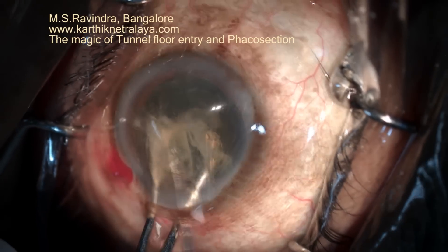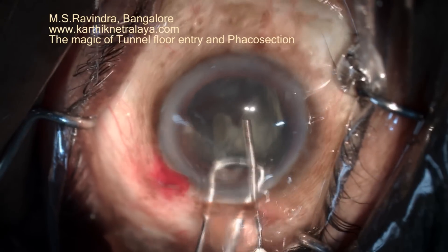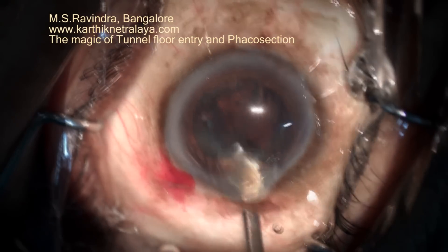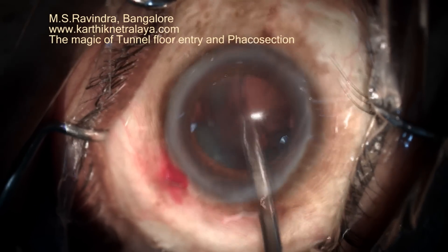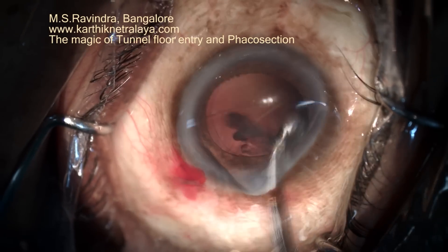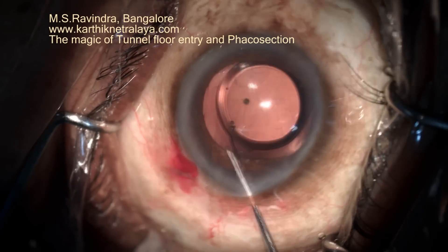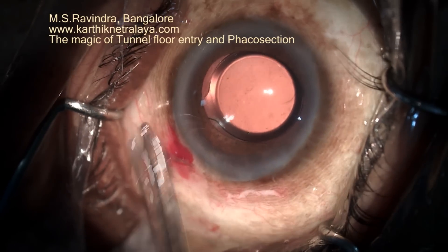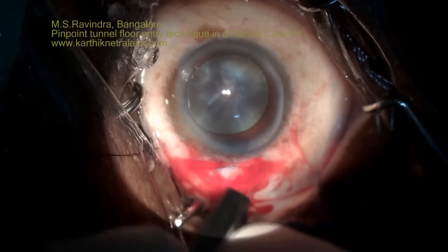There is certainly a steep learning curve in this technique, as it involves performing under topical anesthesia. It involves maximum endothelial conservation, especially as phaco ultrasound is not used. It is a single-tunnel surgery, and the surgeon-induced astigmatism is least — less than 0.4 diopters — and rehabilitation is extremely quick. The conjunctiva and tenons do not need separate management.